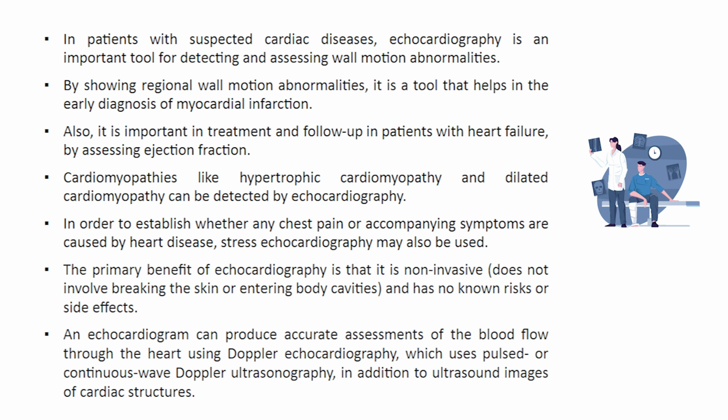The primary benefit of echocardiography is that it is non-invasive, means it does not involve breaking the skin or entering body cavities and has no known risk or side effects. An echocardiogram can produce accurate assessments of the blood flow through the heart using Doppler echocardiography, which uses pulsed or continuous wave Doppler ultrasonography in addition to ultrasound images of cardiac structures.